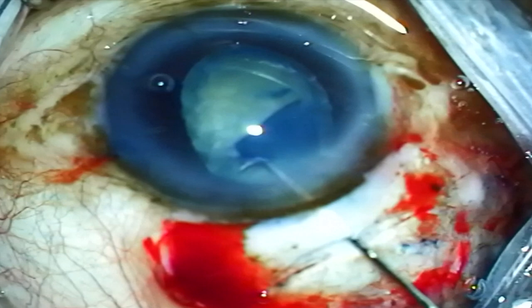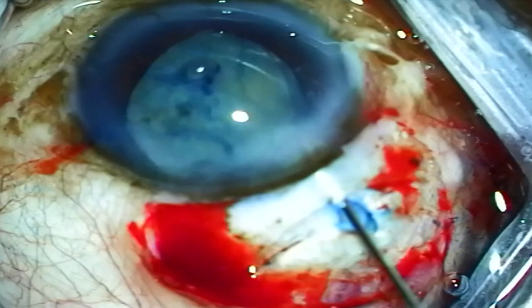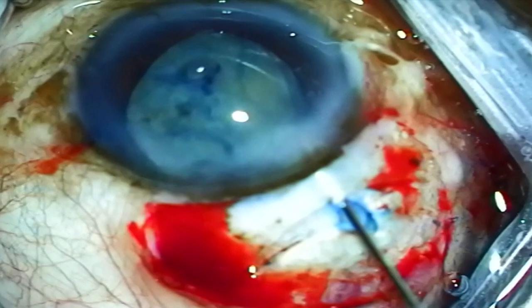This last case is another mature lens with a smaller pupil. The Chang cannula is used to perform hydrodissection and also place some downward pressure on the edge of the lens. The hooked edge of the Chang cannula is useful here in grasping the lens and pulling it into the anterior chamber.